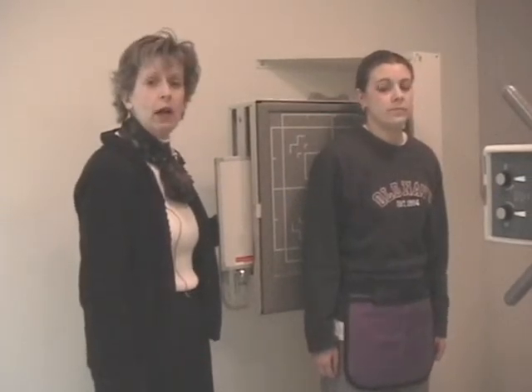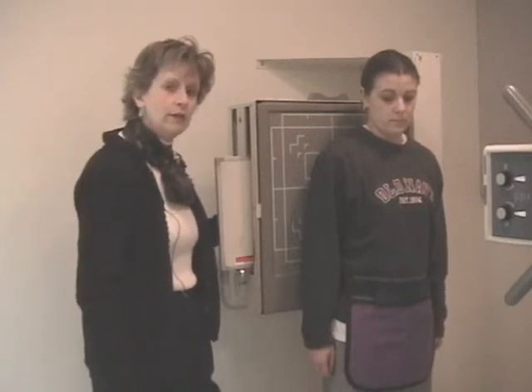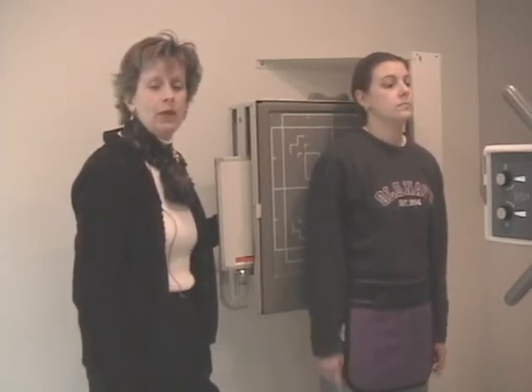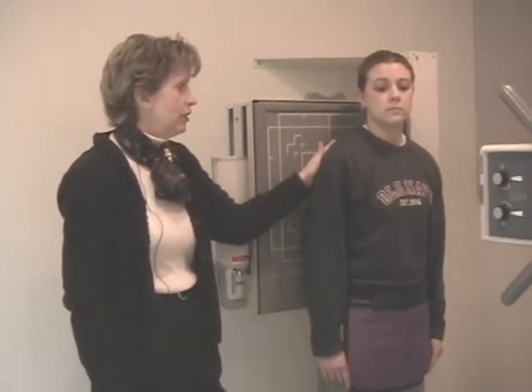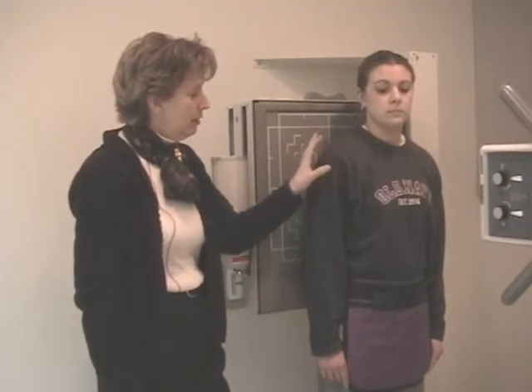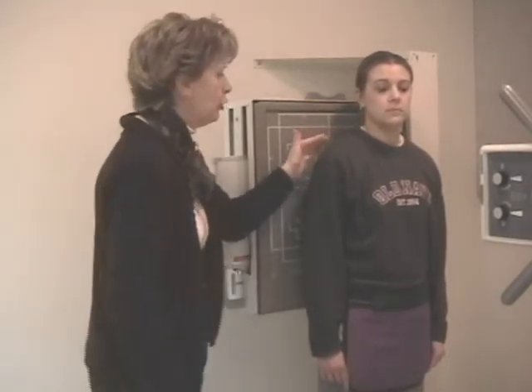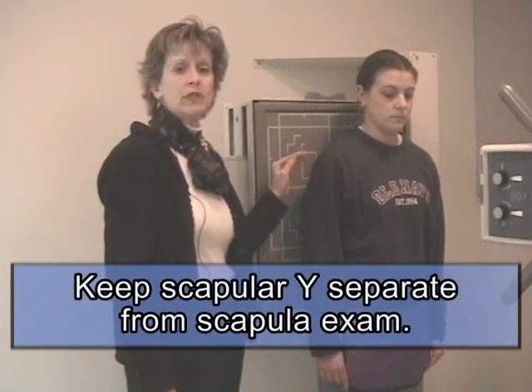A lot of the information we're going to talk about today we've discussed in other lessons. The scapula lateral projection is very similar to the scapular Y, so you won't have a lot of new stuff to learn. But do not confuse the scapular Y with a plain scapula exam. The scapular Y was that orthogonal view to help the doctor determine displacement of a shoulder or humeral exam. A scapula is the shoulder blade. A common scenario is when a patient gets thrown from a horse and the hoof hits the scapular blade — that's not a shoulder or humeral injury, it's of the scapular blade. We're going to do two projections: an AP and a lateral of the scapula. Keep a scapular Y separate from a scapula exam.